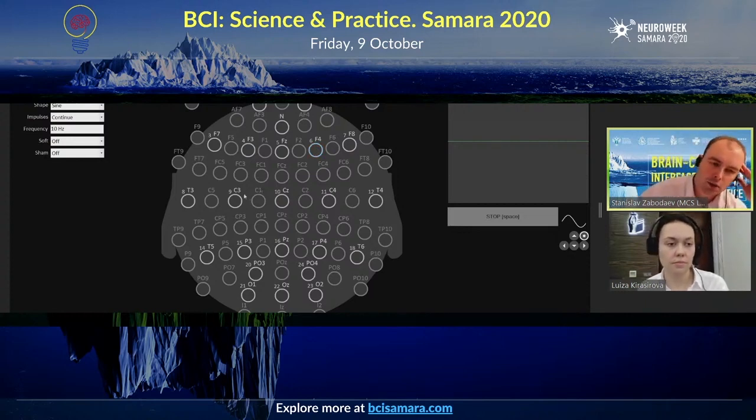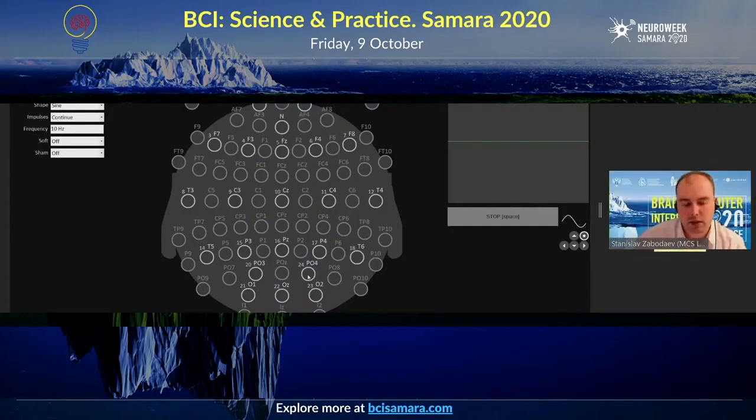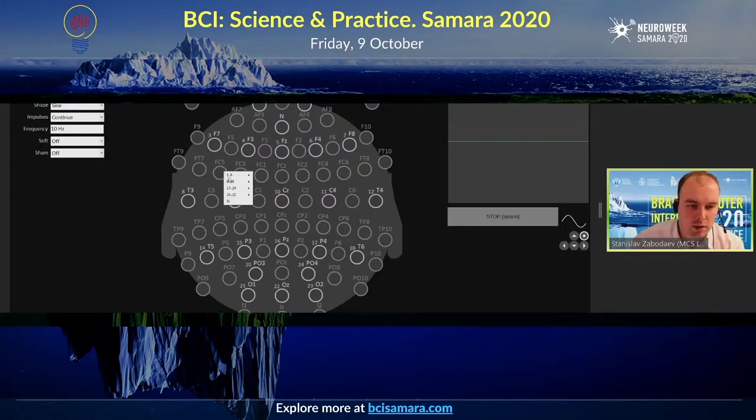Let me show you what I was talking about a few minutes ago. We have electrode C3, channel 9. Here we have 24 channels, and the remaining 8 channels are not here, but we can turn them on.